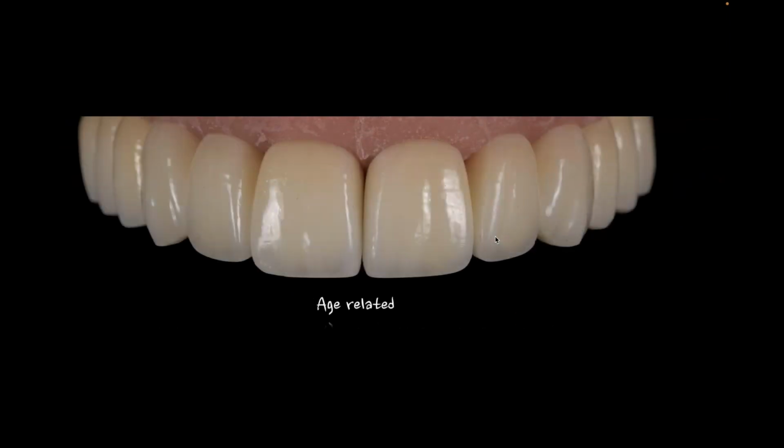So here we are with our final enamel on top, and you can see that I've allowed some of the light to kind of come through, but not all of it. I didn't want it to be a super translucent kind of restoration. So there's our final implant case. These were all 3-unit bridges. It was first molar to first bicuspid, cuspid to central, central to cuspid, and then first bicuspid to first molar again. So really a nice way to break up what everybody considered all-on cases, right?